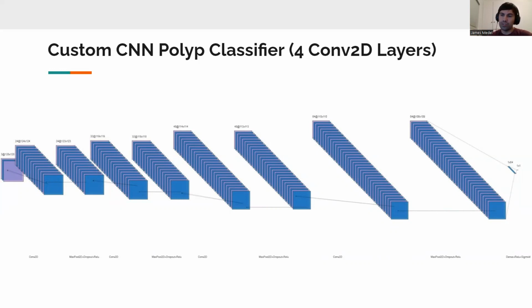And what the convolution layer does is it will output what are called feature maps. And each of these feature maps has on them the edges and the labels. And then max pooling, dropout, and ReLU are performed on those feature maps. Max pooling is done to reduce the noise, so then our model can focus on the most important features. Dropout is used to prevent overfitting, helping our model to generalize better on data it hasn't seen before.